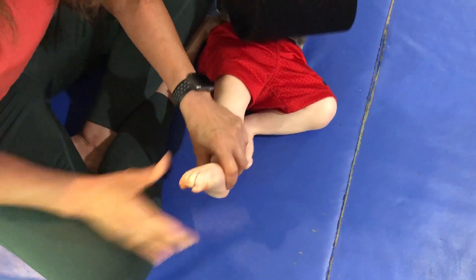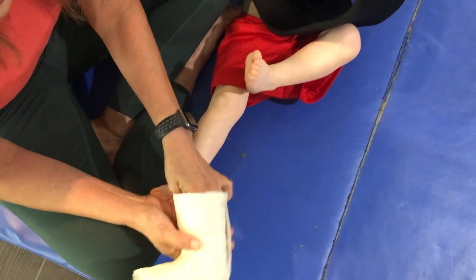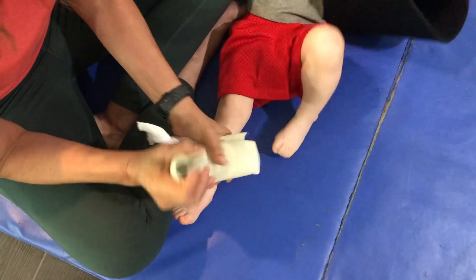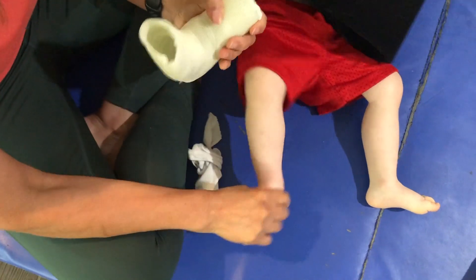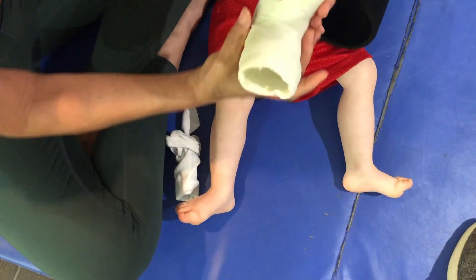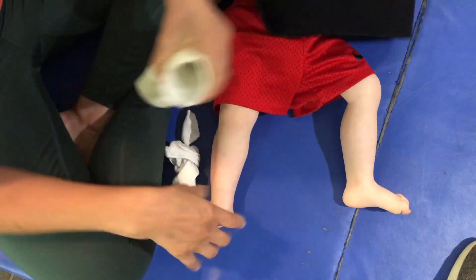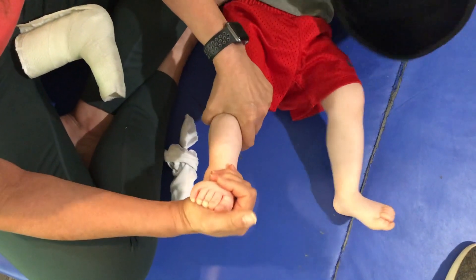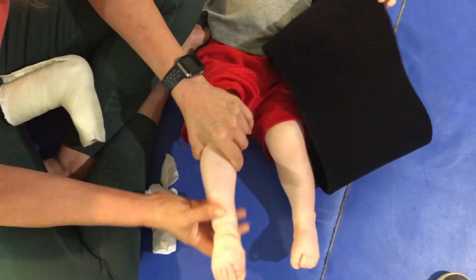So what we need to do is dynamic flex cast, which is a flexible material — you can actually bend this — and his foot is going to move into position, but only in the appropriate direction, by letting the leg do this and training his foot in the appropriate direction.